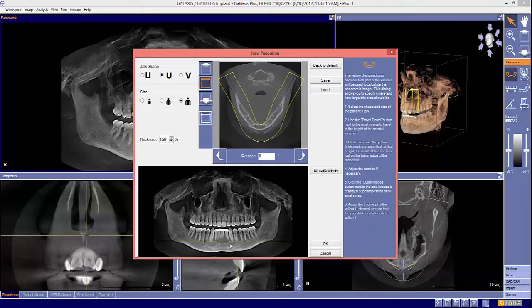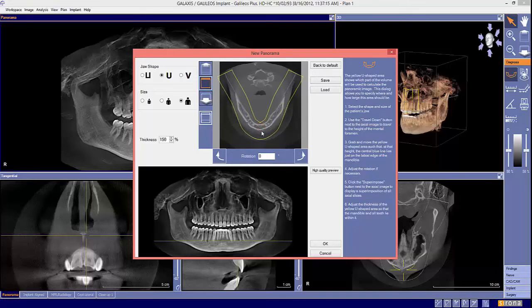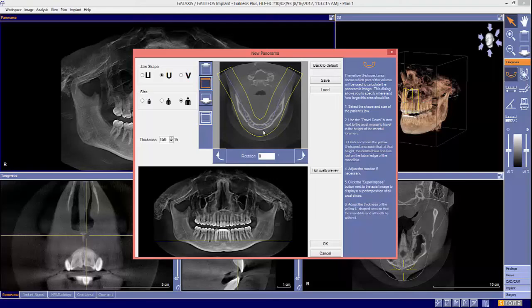Once we're there and seen in both windows, left-click, hold, and drag the panorama curve until the blue line is within the bone. You can change the thickness of this panorama curve here.